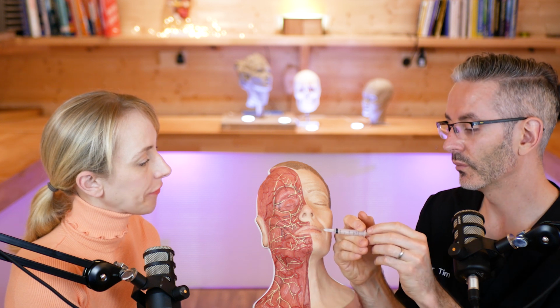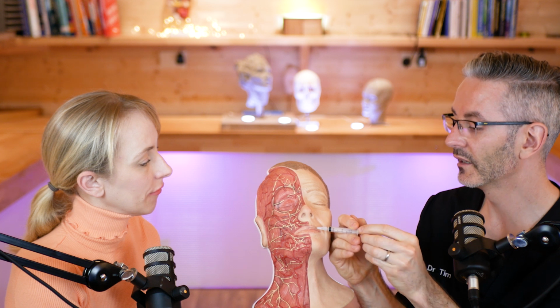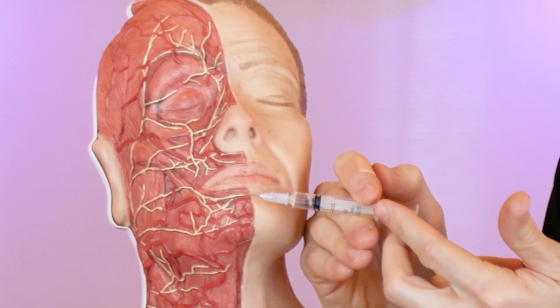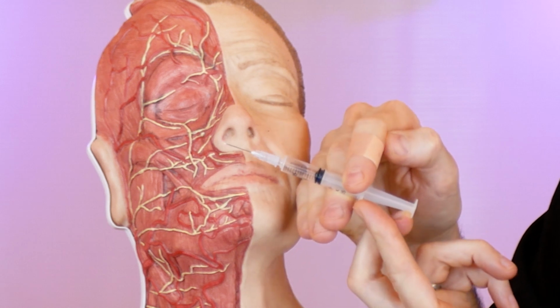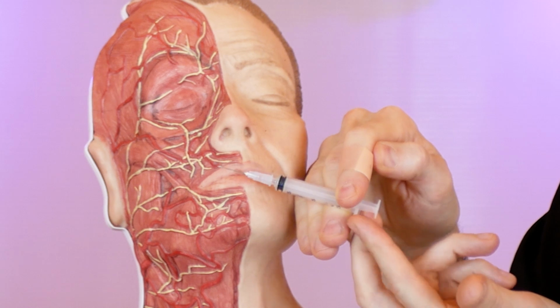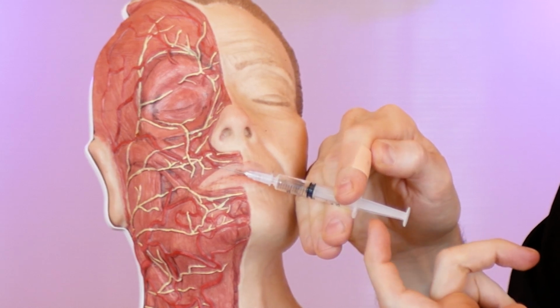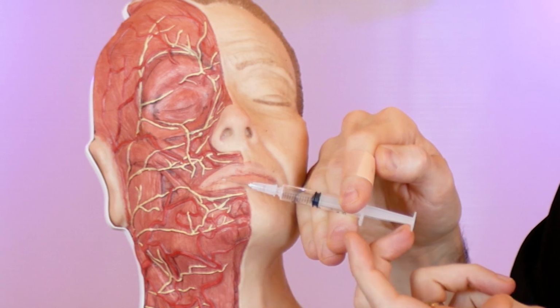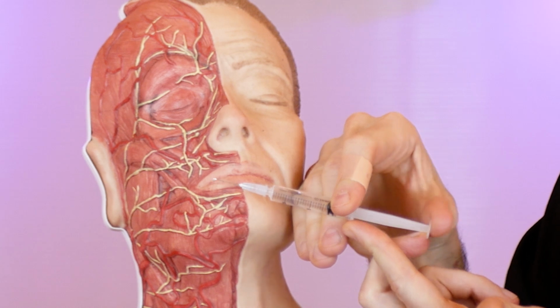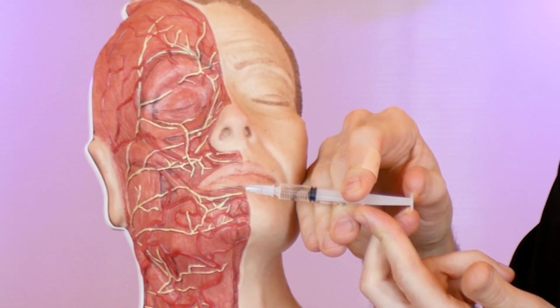In fact, it's the way you do it with this side as well. If you're going to aspirate using your left hand and stabilize with your right hand, you still do the same thing. You push with one finger and pull with the other finger. So I don't know how well that can be seen. I'm sure Shati can zoom up on that process. I'm actually pushing the one plastic area away and pulling with the other, so the net force across my hand is zero. And that's the key with a stable aspiration. You can see that needle tip is not moving much.